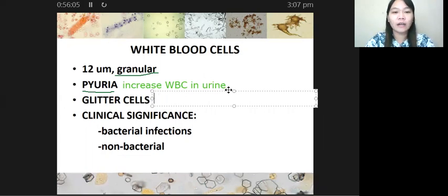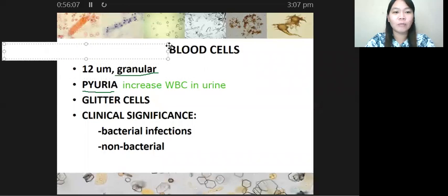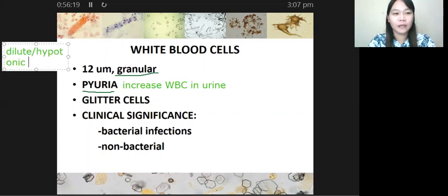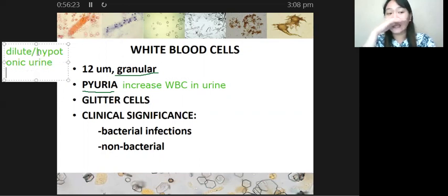Class, I'll write this on the side because it's a bit long. So, WBCs in dilute or hypotonic urine are referred to as your glitter cells.